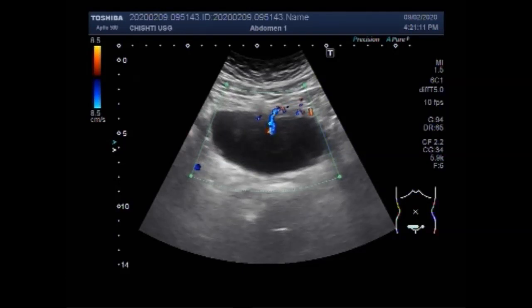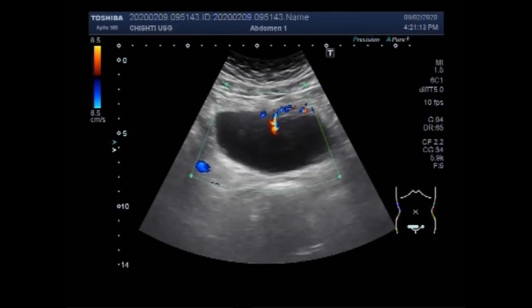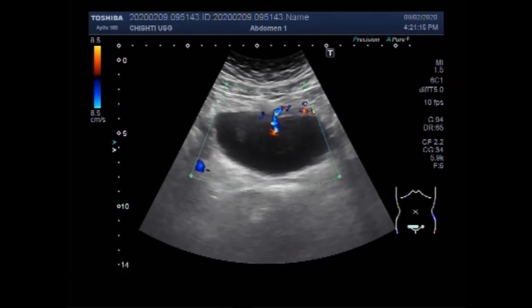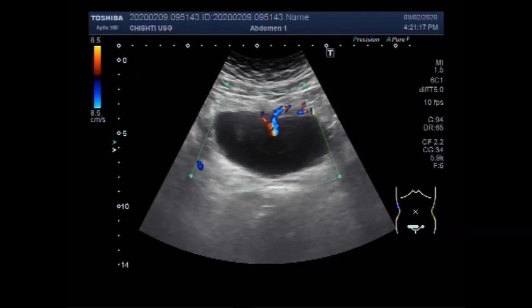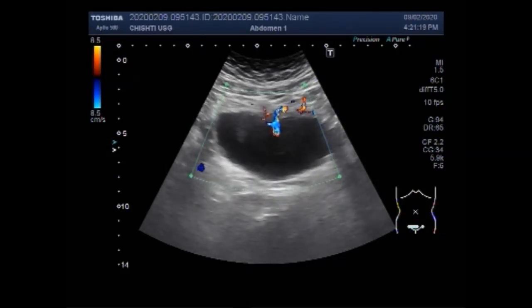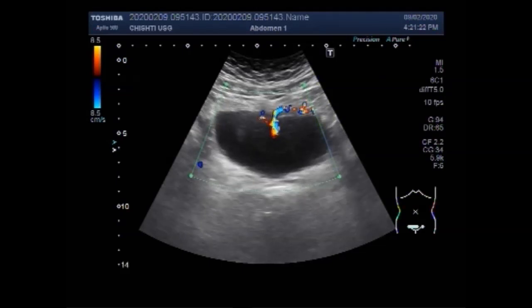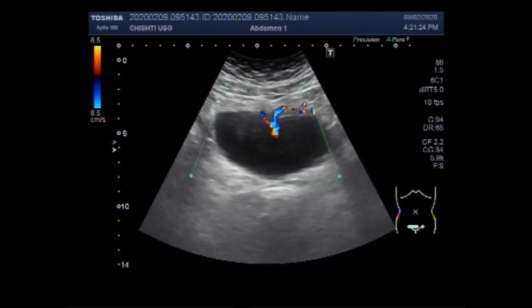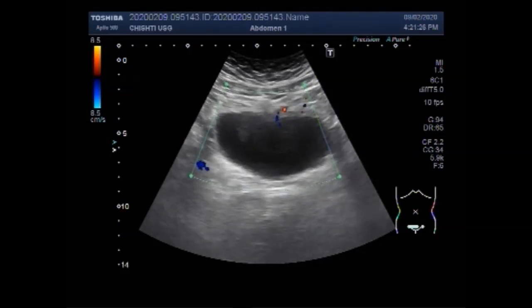You can see quite significant blood flow inside the mass. So the likelihood of a malignant mass is there.